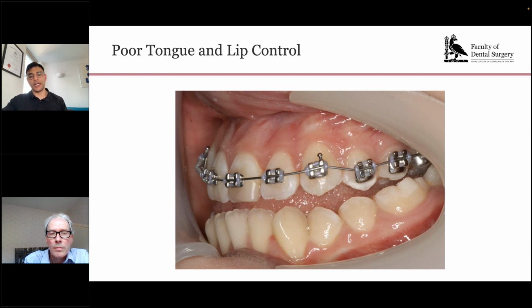And especially if you're going to be using this camera and giving it to assistants, or you're going to be leaving it at your workplace and there's a possibility that somebody else could use it who's not so careful with it. You want to be going for something that you're going to use consistently and you're not going to be worried about damaging, because wear and tear will happen.